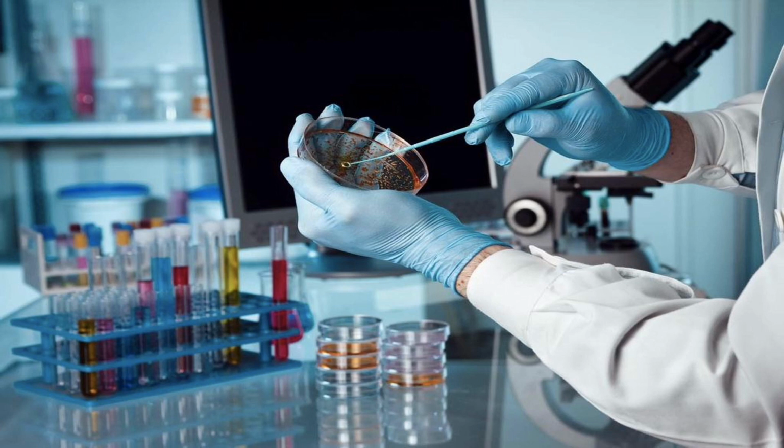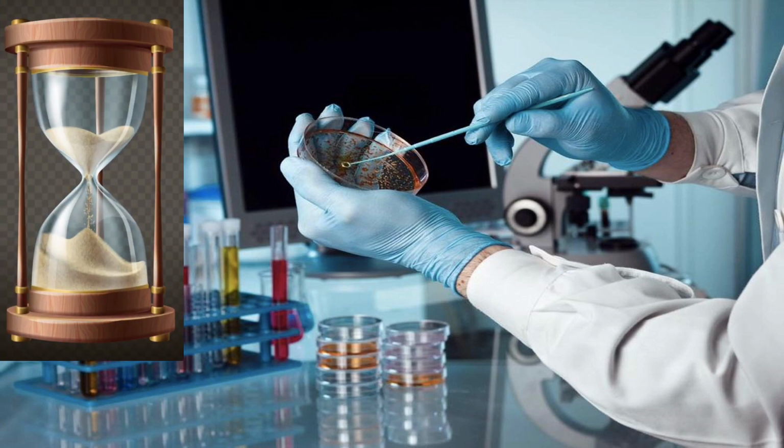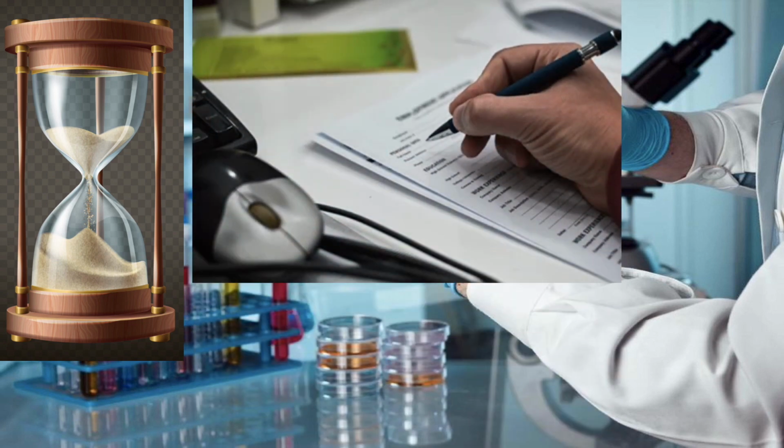Grinding the samples may decrease viability and is not a good idea. All samples must reach the lab within 2 hours of collection. Remember to fill the requisition form completely and include the history and findings too.